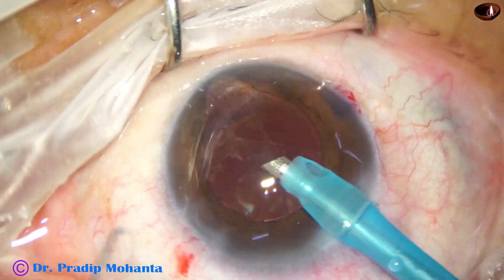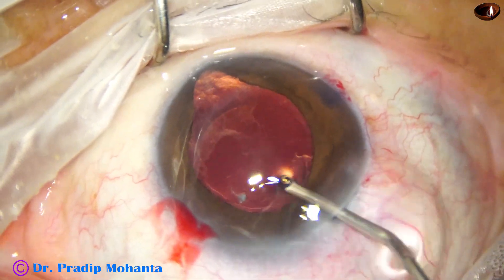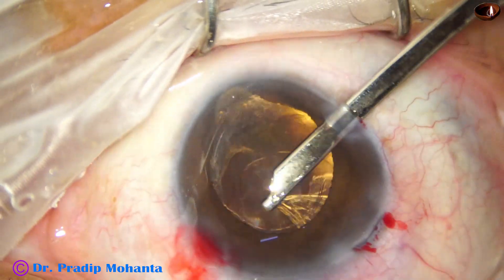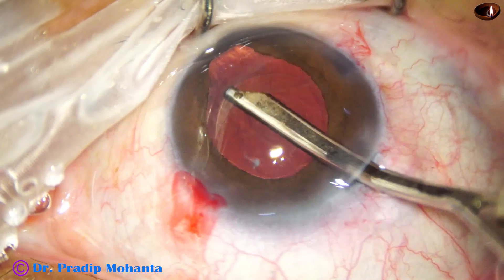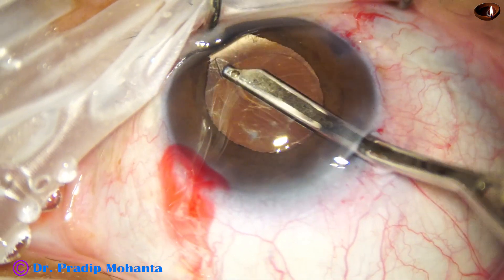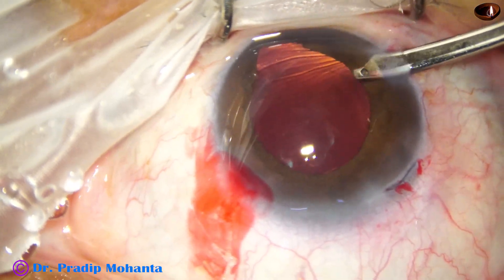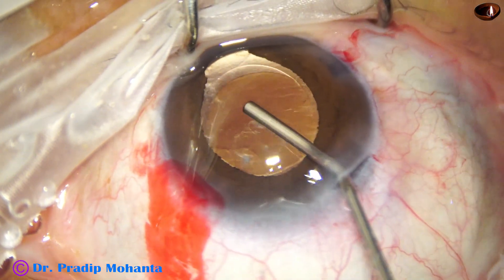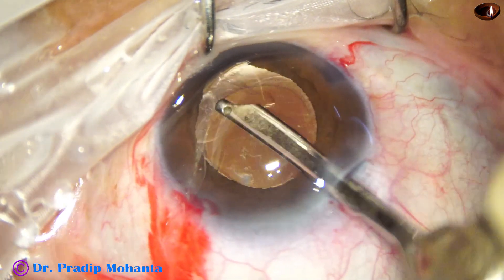Now is the time to manage the cortex. I inject some visco and fill up the anterior chamber and the capsular bag. I take a Simcoe cannula, go through the side port and remove the cortex at 11 o'clock, which is the sub-incisional cortex. Then I try to remove the cortex from the colobomatous area — always remove the cortex from the colobomatous area last, with extreme caution. Don't hold and pull the capsule. I fill up the anterior chamber and inflate the capsular bag with visco, then finally remove this cortex.